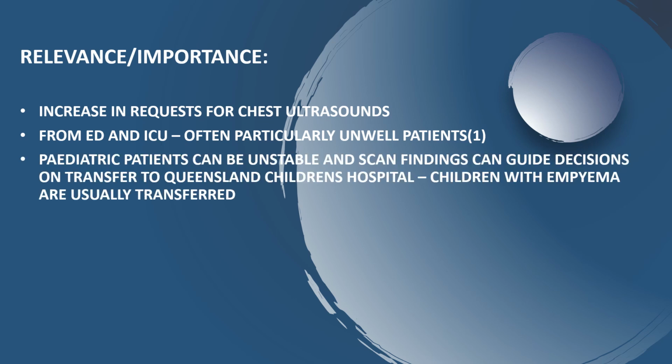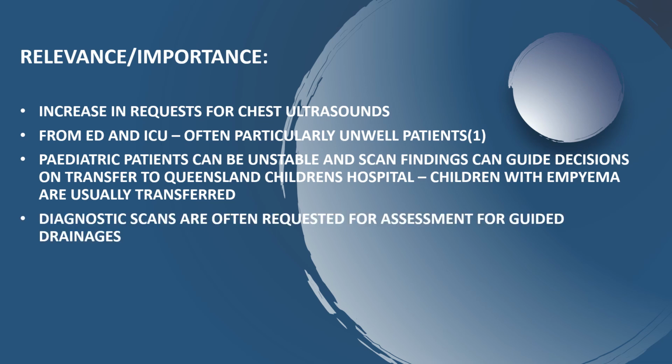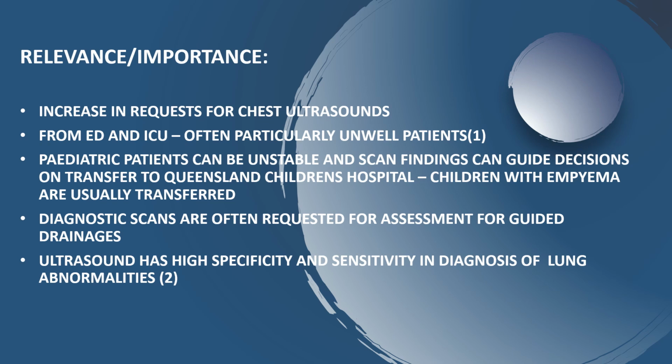Pediatric patients can be quite unstable, and the scan is often used to guide decisions in transferring those children to Queensland Children's Hospital in Brisbane. Those with empyema are generally transferred away from Rocky, so it's quite important that we get that right. Diagnostic scans are often requested for the assessment of guided drainages, which then we do in the department, obviously. Ultrasound is very good at diagnosing lung abnormalities, and it's fast, low cost, portable.